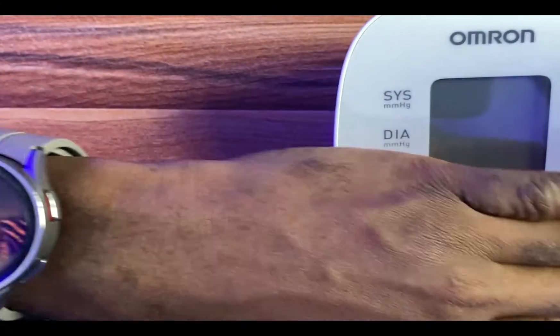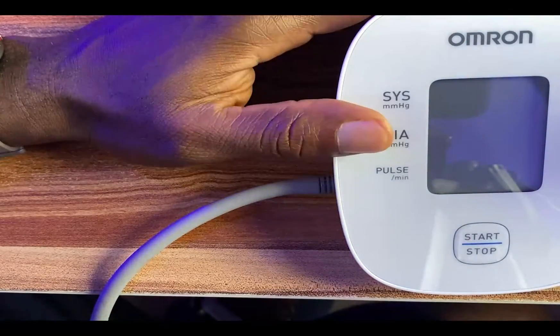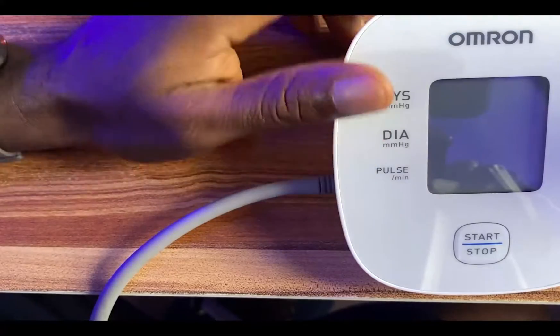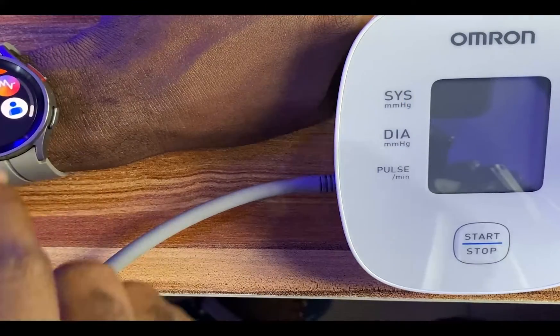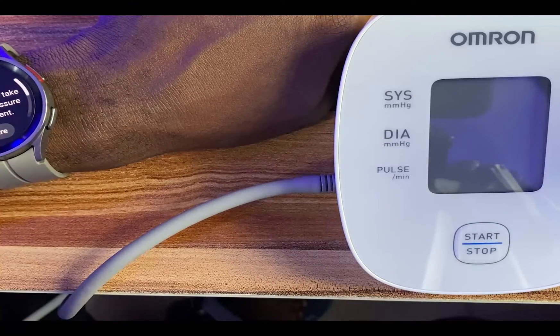I'm going to be comparing the blood pressure measurement accuracy of the Galaxy Watch 5 Pro against the Omron blood pressure monitor. I'll simply go to the Samsung Health monitor app and tap on this — this is my previous measurement.